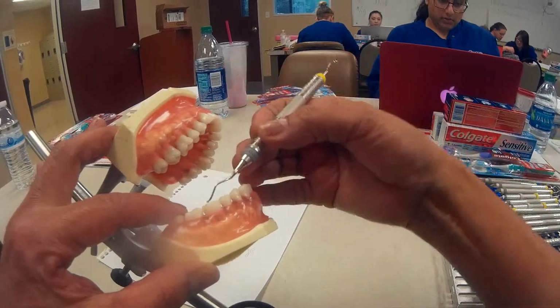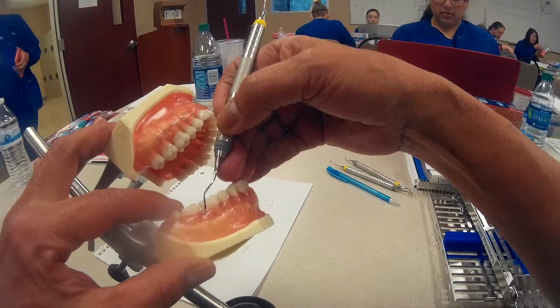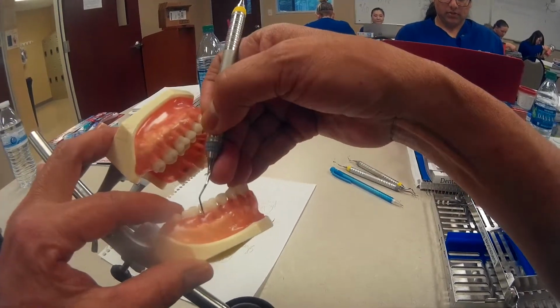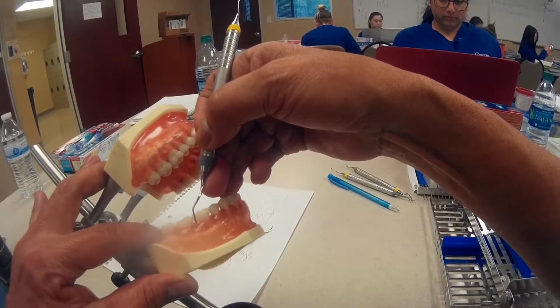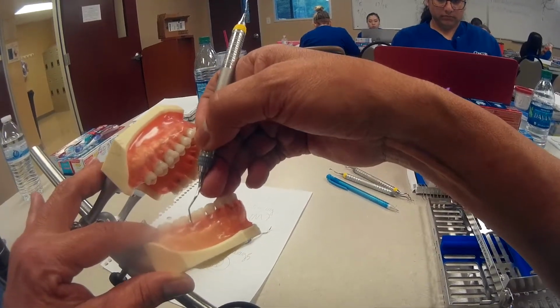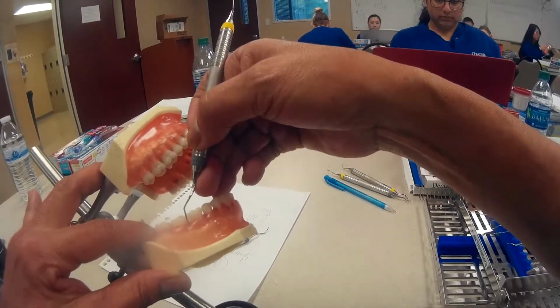And then I back round it into the curette, goes into the sulcus, and then I'm going to stand it up, okay, so that my terminal shank is parallel. So when this working end is in a sulcus, the only visible clue that I have that I'm correctly adapted is that this terminal shank is standing straight up.